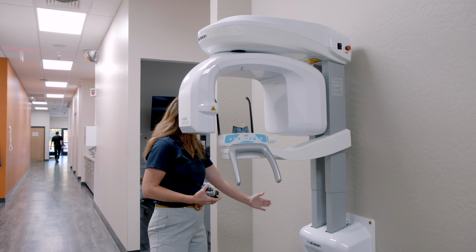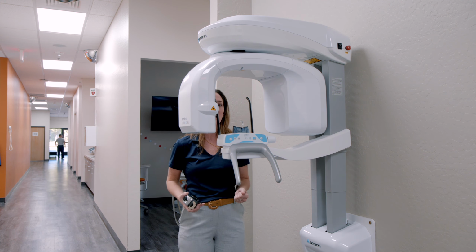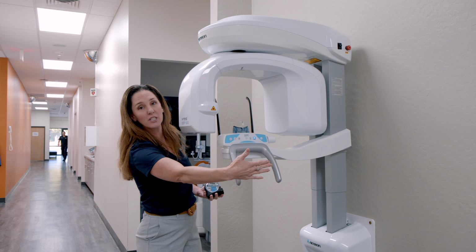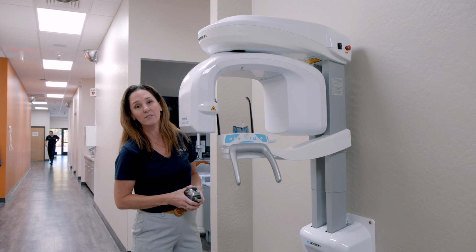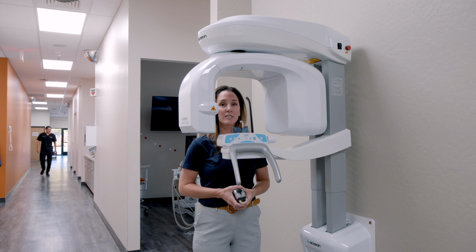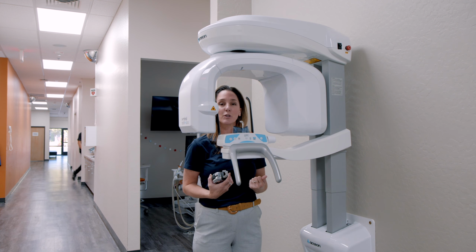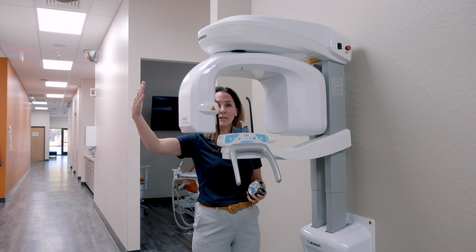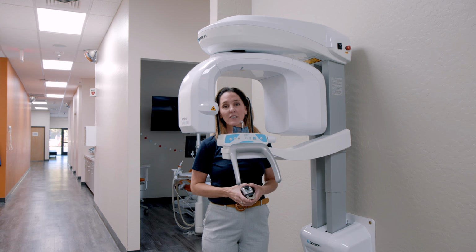But you do want to give your patient enough room. So if we're looking at the unit, your patient is going to enter in on the left side of the unit, and you are going to be positioning them on the right side of the unit. The patient is facing outward, so it's nice because they're not going to feel claustrophobic. And again, if you had a pretty narrow wall, we're going to make sure that we're going to get everything in a pretty compact space.